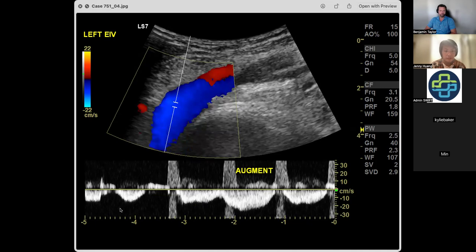So that's saying augmenting. Yeah. I'm not sure if there's pressure being pushed distally on the limb, and so there's increased venous flow. I'm a bit confused why it's in the same direction. Yeah, so what we'd normally see is the normal variation with a bit of breathing. And then that's the actual bit there where we tried to augment. And I agree, it's a bit hard to say because it's pretty poor augmentation, isn't it?